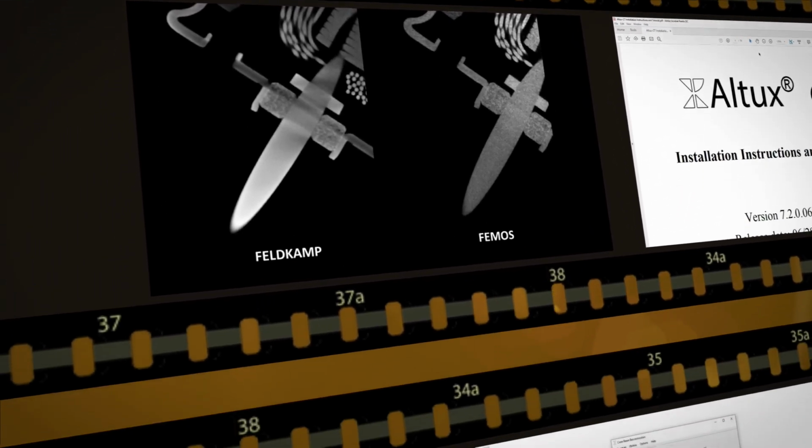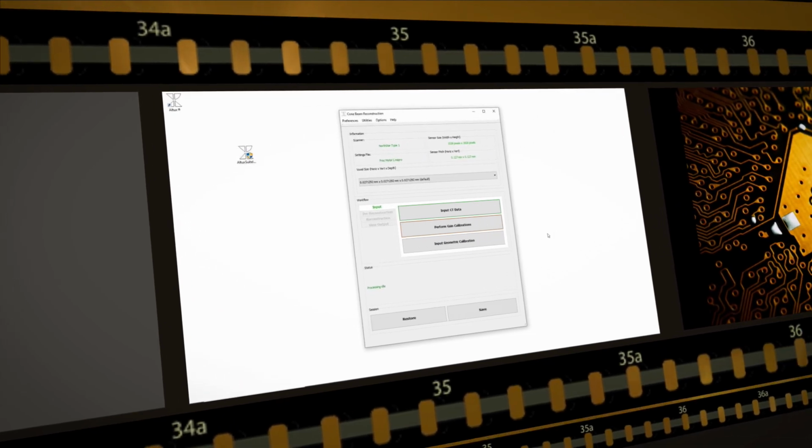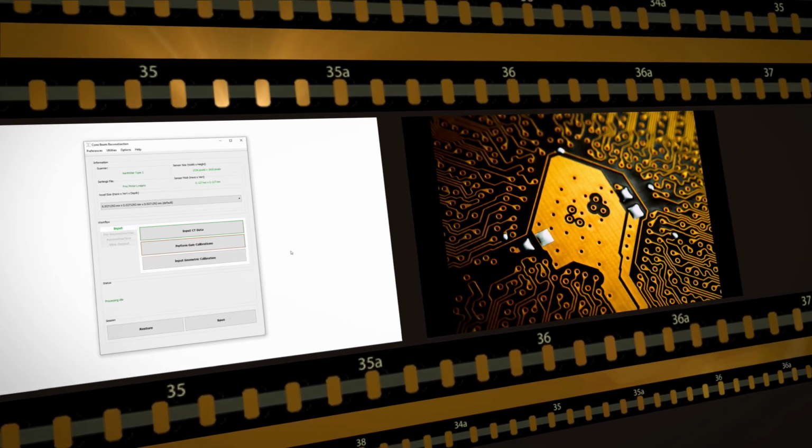This concludes the training video on the main components of the Cone Beam tools in the Altux CT software package.